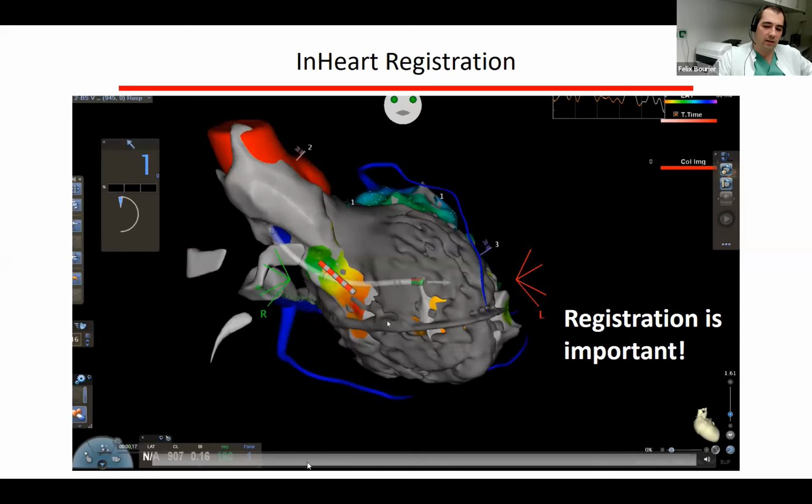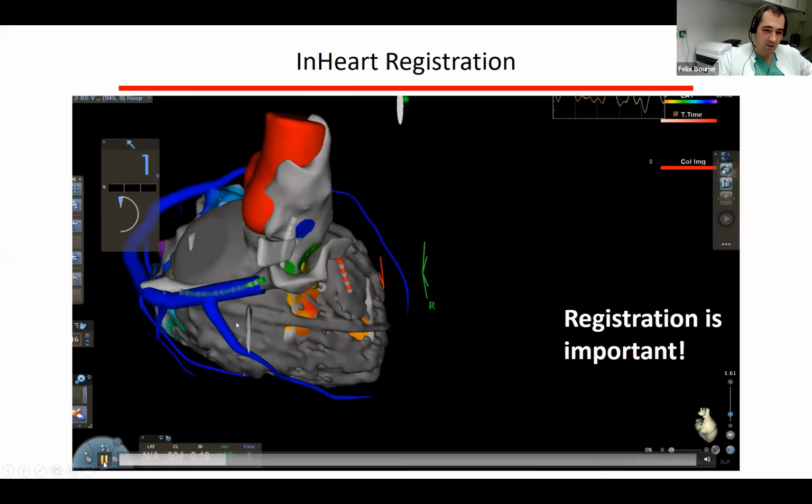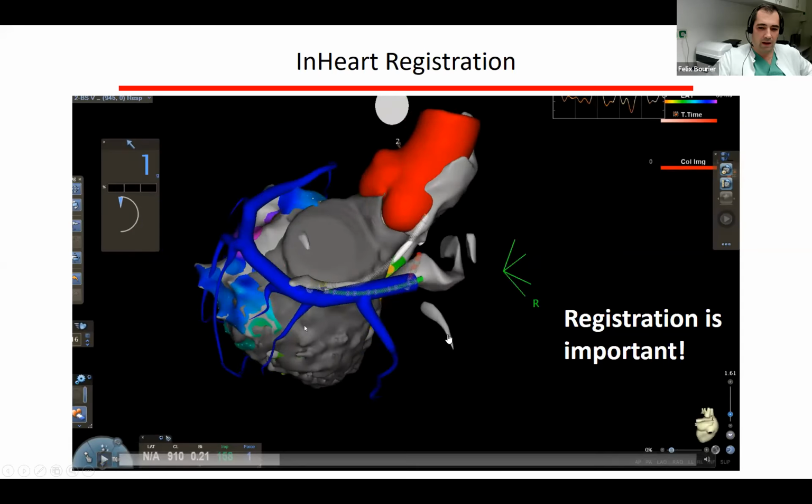In this case, I did only the proximal branch of the CS because, as just discussed before, it was a bit hard to advance the catheter inside. It's nice if you can get the lateral and the distal parts of it as well, and or even some ventricular branch, and the apex of the left ventricle.